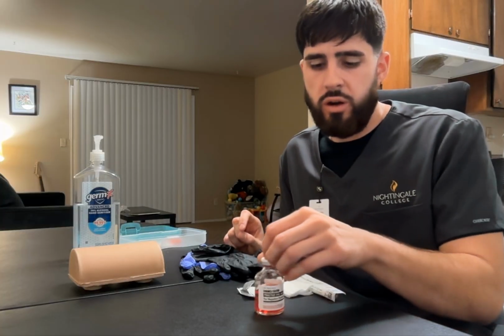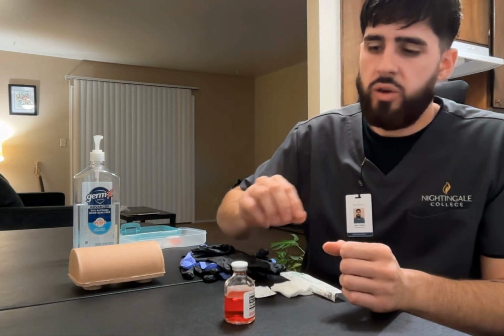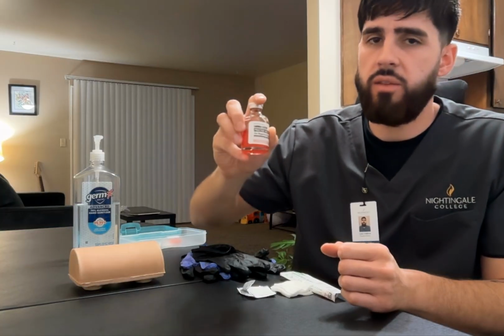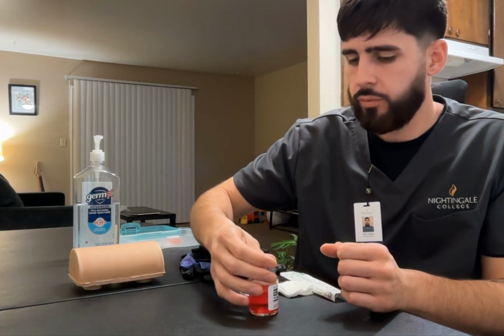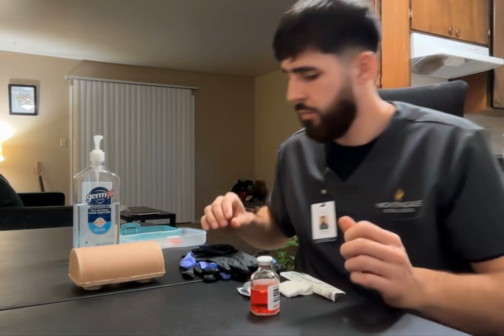I'm going to open the drawer and check that I need tuberculin. Look at my MAR, make sure that that's the right drug. I'm going to pull that drug out, hold it up to the MAR, make sure that I have the correct drug at the correct dose, which is 5 TU per 0.1 ml.